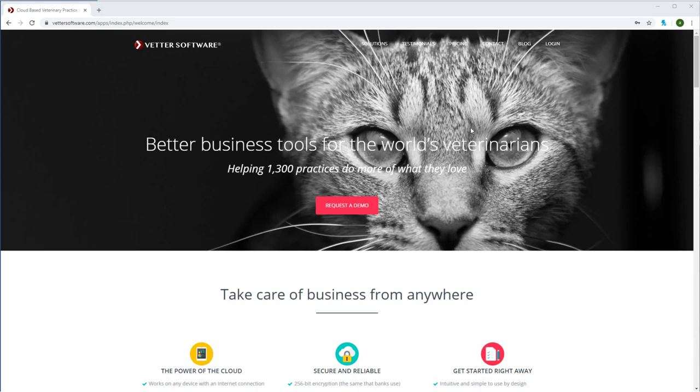After images are acquired they are immediately available in the Keystone viewing suite as well as the Vetter patient record. You'll also be able to pull up your images in Keystone directly from the Vetter patient record. Let's get started and I'll demonstrate the entire process for you.